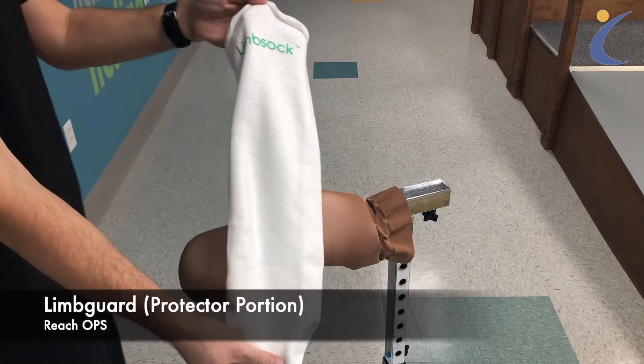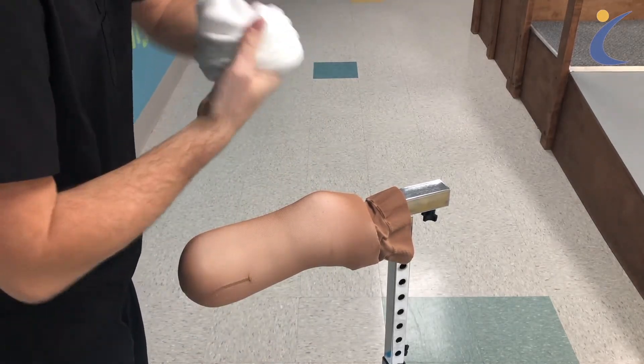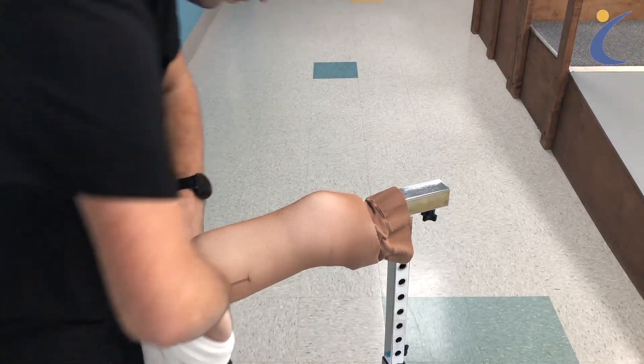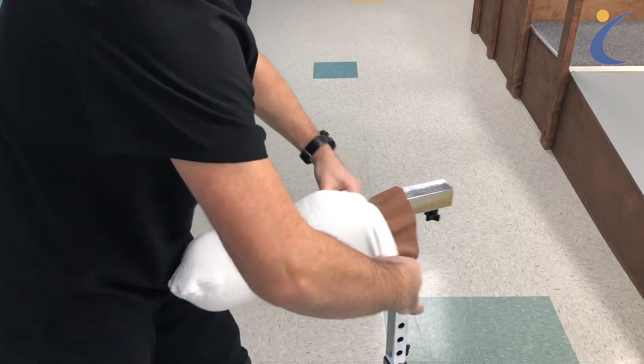To apply, have a prosthetic shrinker already on your leg. Stretch out the limb sock to make application more comfortable. Pull the sock up along your residual limb and ensure no wrinkles are present. The sock helps to prevent irritation from the plastic material against your skin.